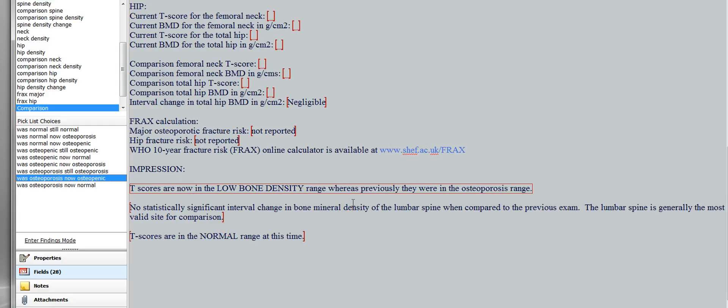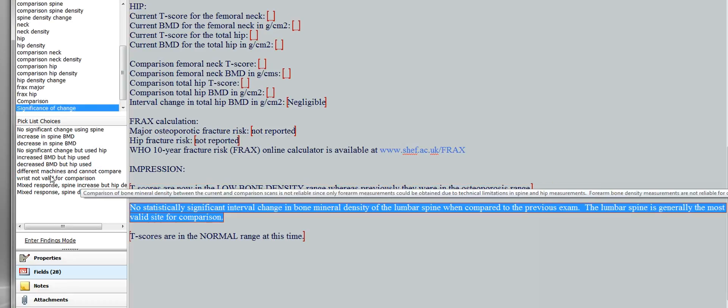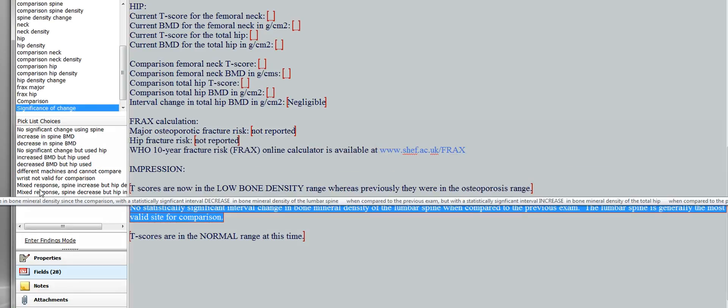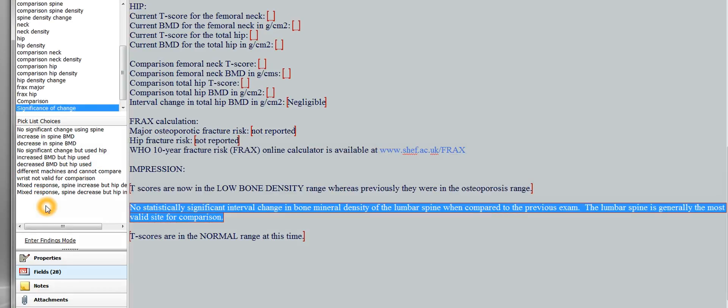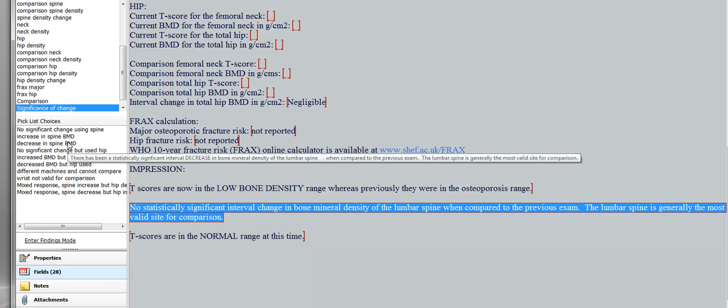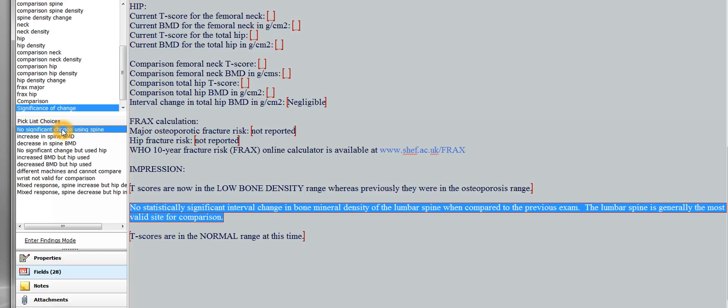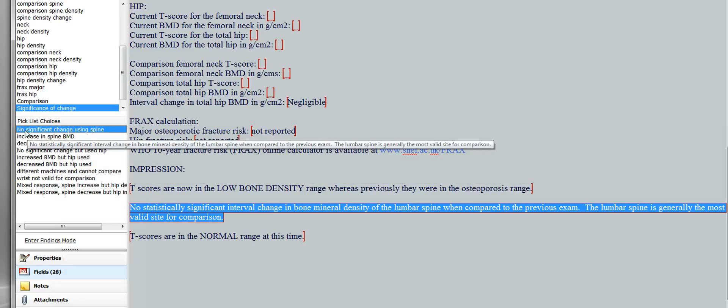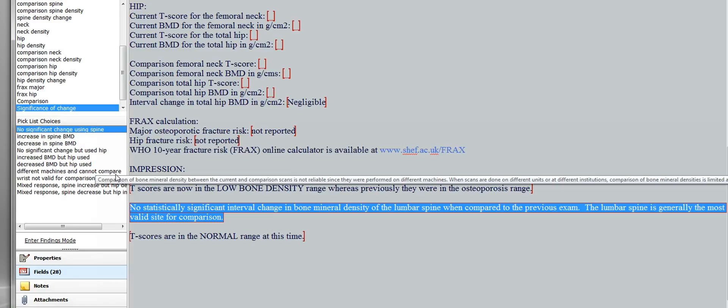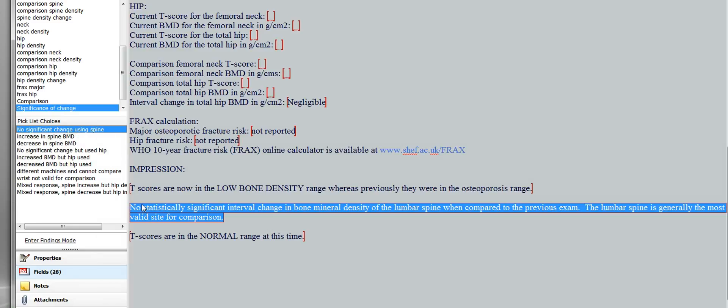All right, then the second impression is, next one, let's tab into it. And it also has a nice pick list, so be sure to use the pick list. And this is the most complicated one, and it's about how to say whether there's been a statistically significant change in bone mineral density. So this one you'll use commonly. It's going to say there's no, the shortcut is no significant change using the spine. So it'll say no statistically significant interval change in bone mineral density of the lumbar spine when compared to the previous exam. The lumbar spine is generally the most valid site for comparison.